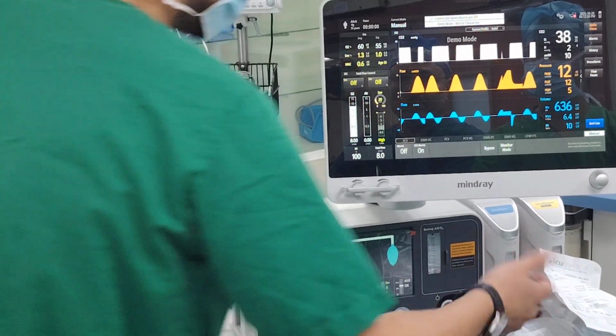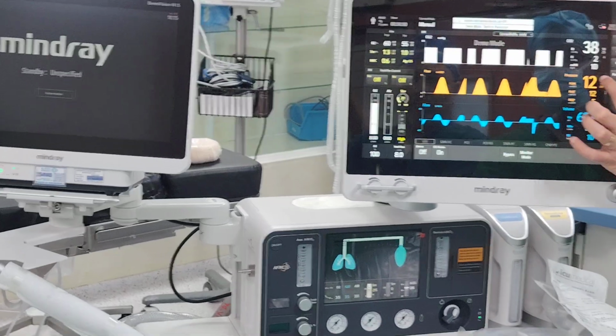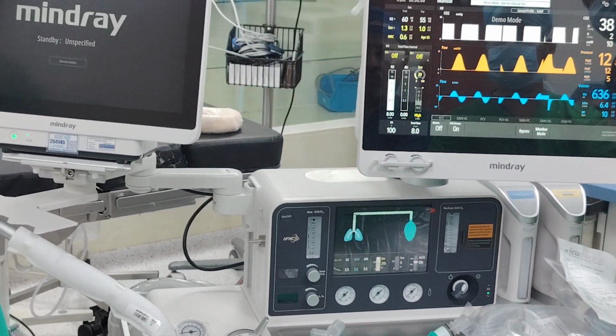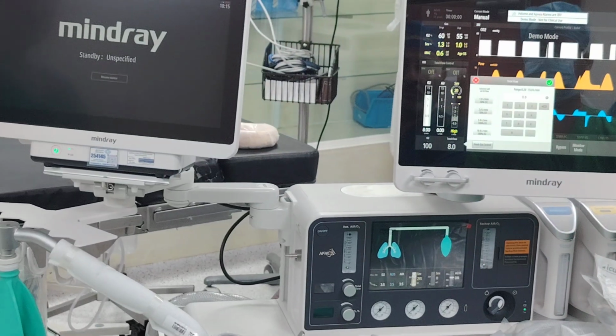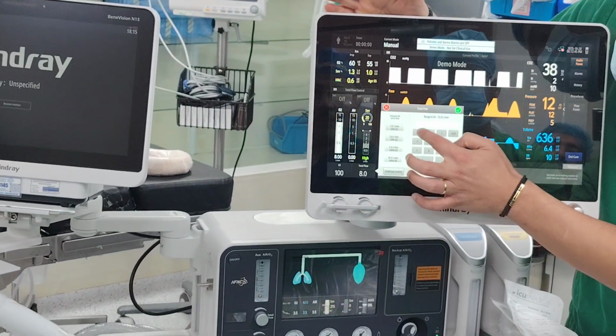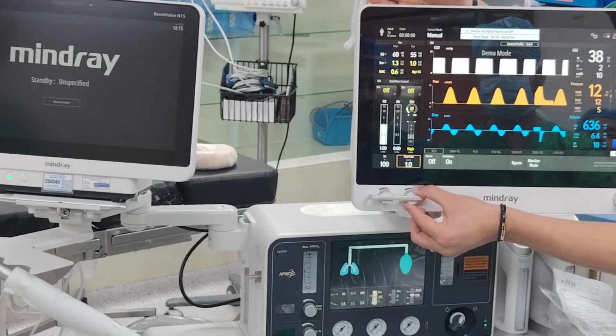Okay? Depending on what suits you. Now, you have definitely the CO2, the peak pressures, the volume. Here is, you're very familiar. You can click on the total flow. You can go down here, go up. You can put the measurements as you want. One, press check here or press check there. Or you can play around from this one.